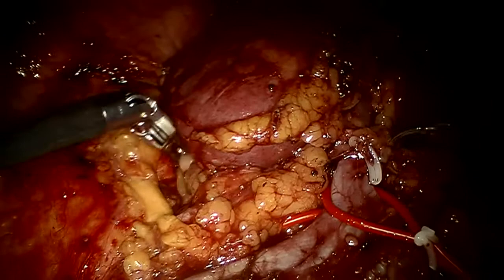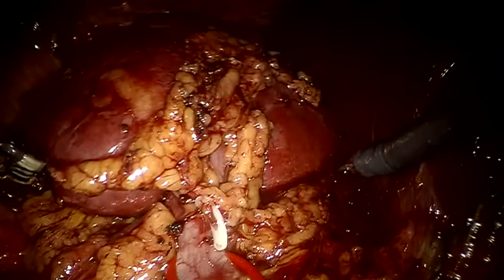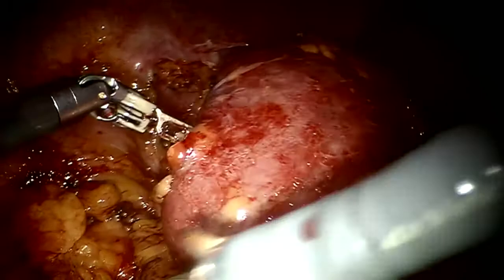So basically it is critical to free up the ureter from the lower pole of the kidney if you have to rotate the kidney. This has to be disconnected or you cannot rotate it well. And of course, it has to be freed from here. Then we have left a little fat intentionally over here as a handle. And here is the kidney now being flipped around.